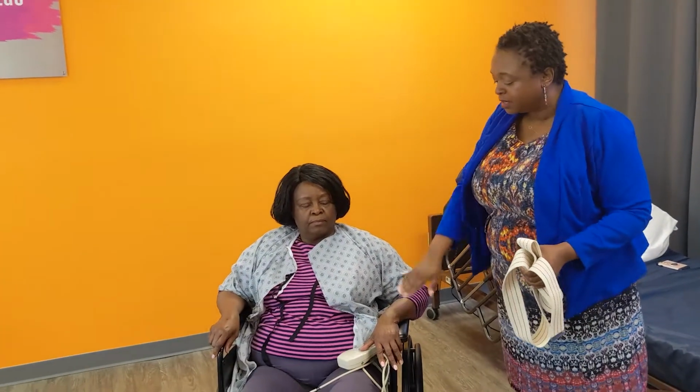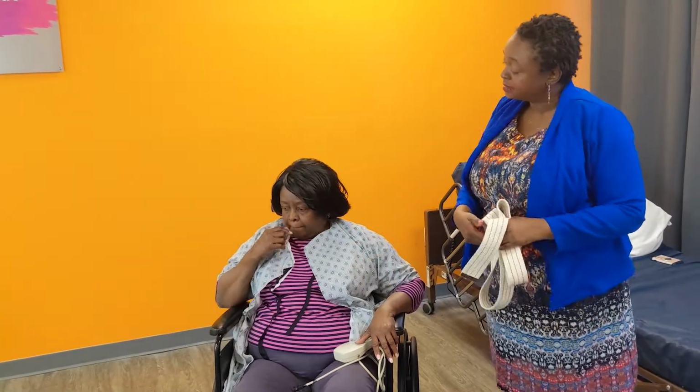Okay, there's no documentation required for this skill. The wheelchair is locked. The patient has the call light. The patient's comfortable. I will exit the room, open my privacy curtains. I will do hand hygiene, and I'm done.